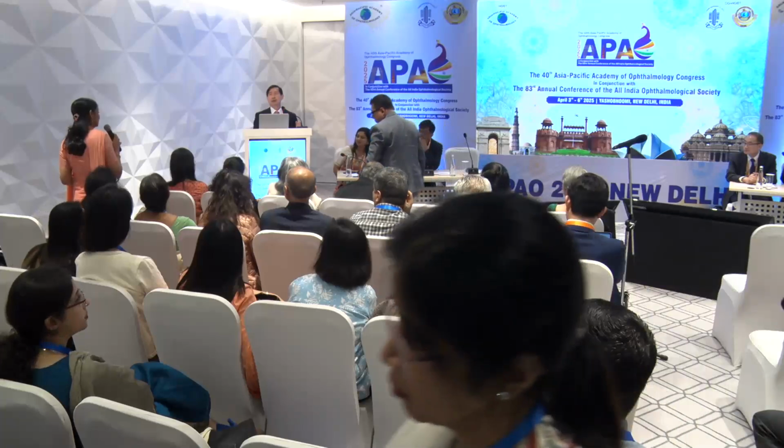I have a question to you, sir. How do you monitor actually? I think no investigation is reliable. Every OCT, HVF, everything has its own plus and minus. But how do you in general monitor them with one single investigation, or do you have OCT-A also in your list of investigations? We monitor by all modalities: photograph, OCT, visual field, at every visit. Right, okay.